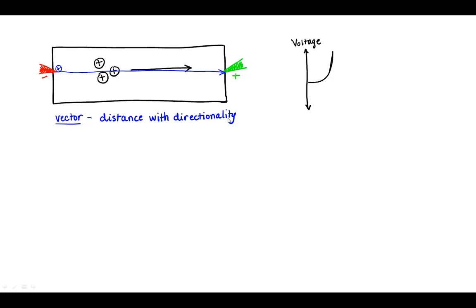And it turns out that how well charges' paths align to the vectors that exist between electrodes determines how excited the electrodes get when they sense that charge moving around. So in this case, since the charges are moving in a direction that's parallel to the blue vector, there's going to be a positive deflection or change in voltage when the voltage reading comes out.